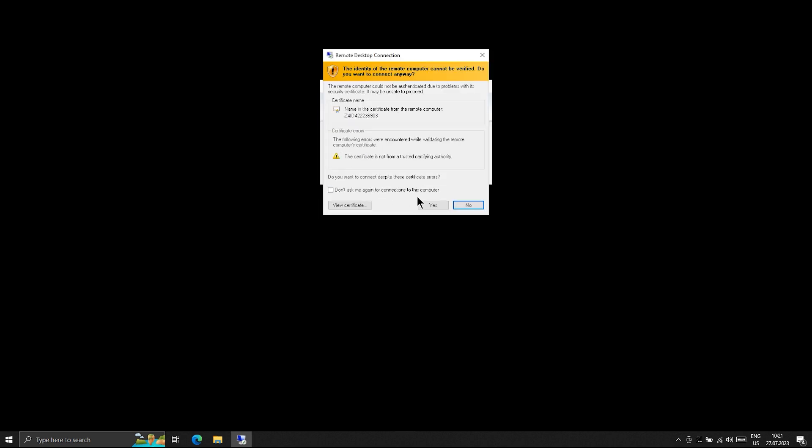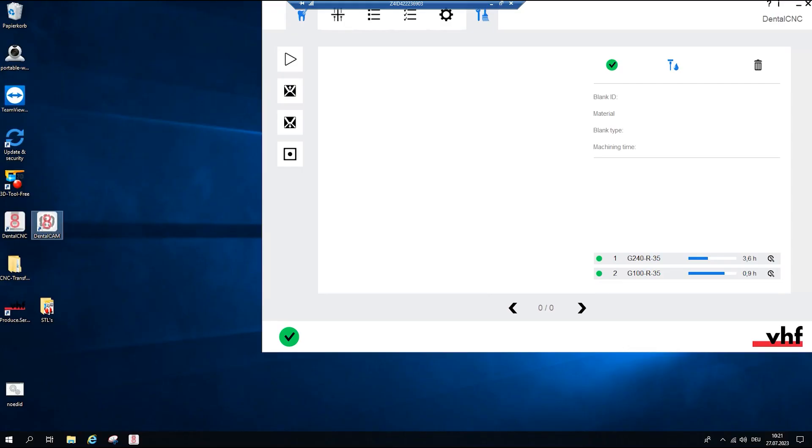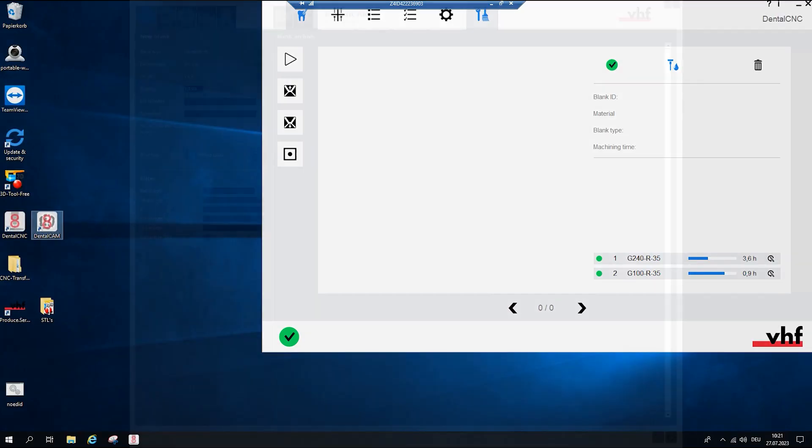Confirm the message. The desktop of the CAM computer displays in the Remote Desktop Application window.